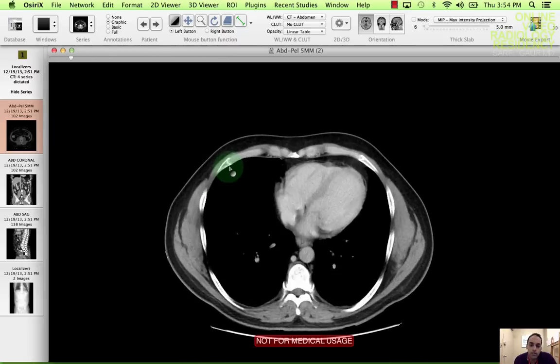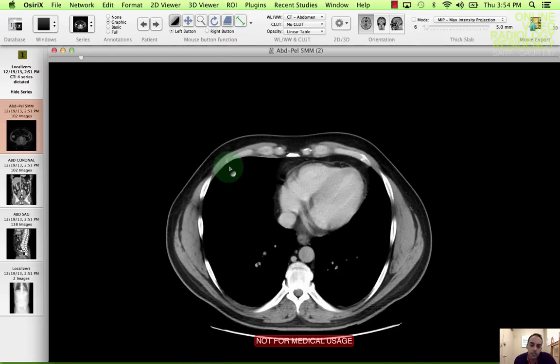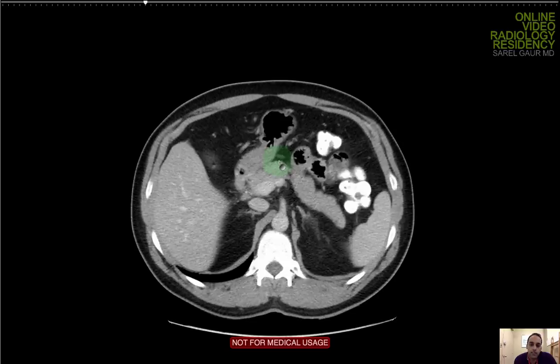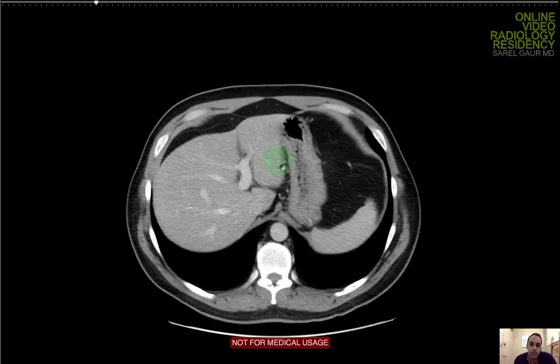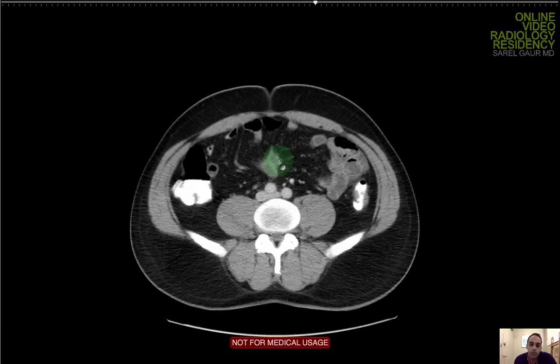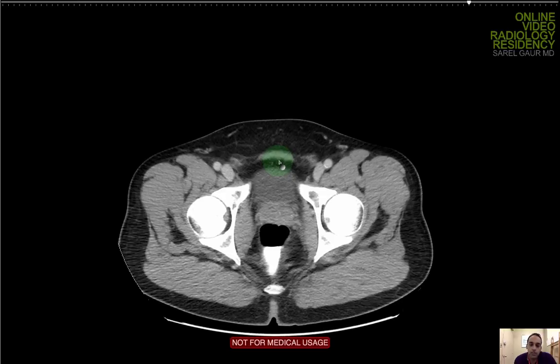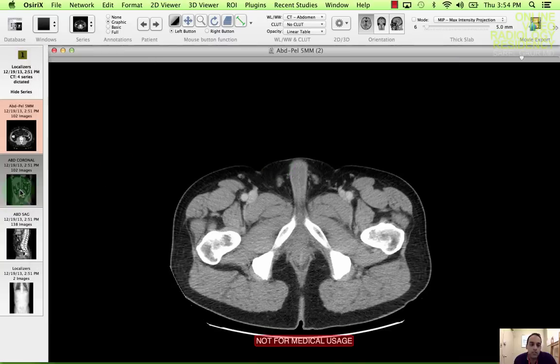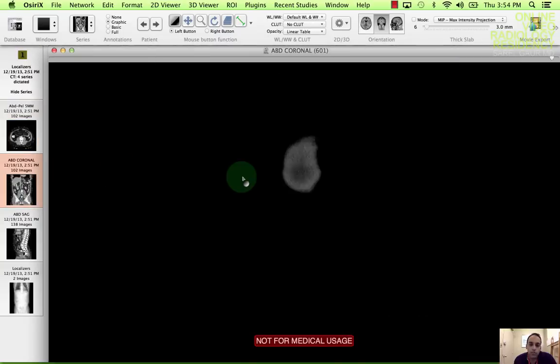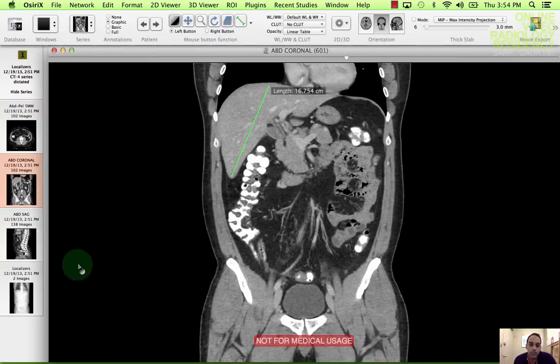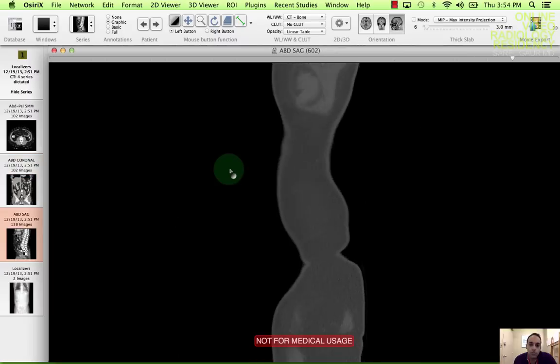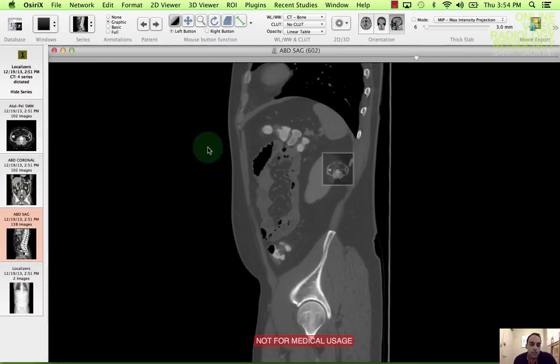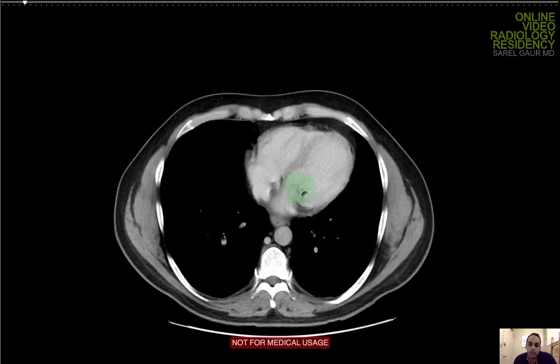So first, the history is abdominal pain. The technique: contiguous axial CT images of the abdomen pelvis from the lung bases to the pubic symphysis. I have coronal and sagittal reformats available for review, and I'm going to start with the axials.